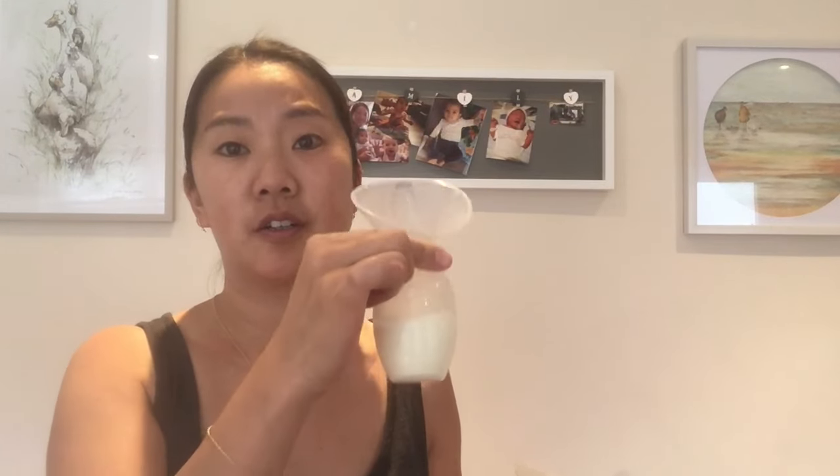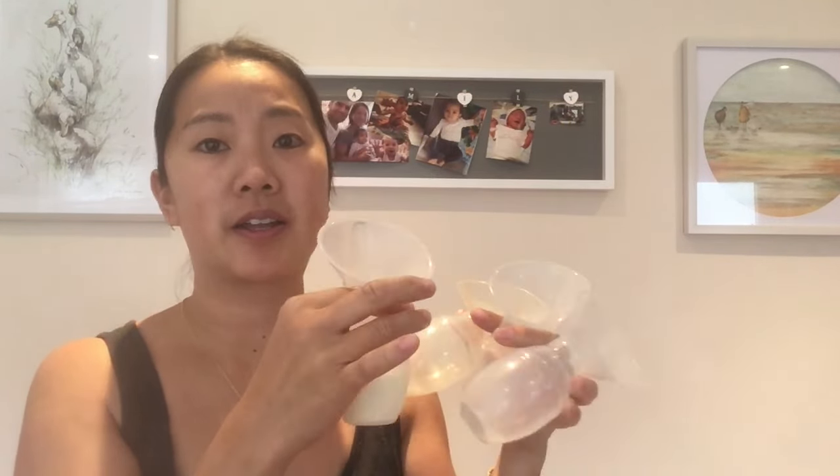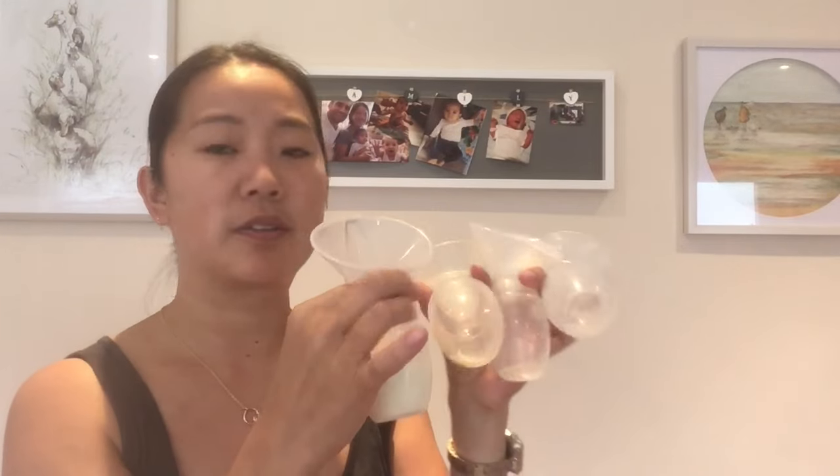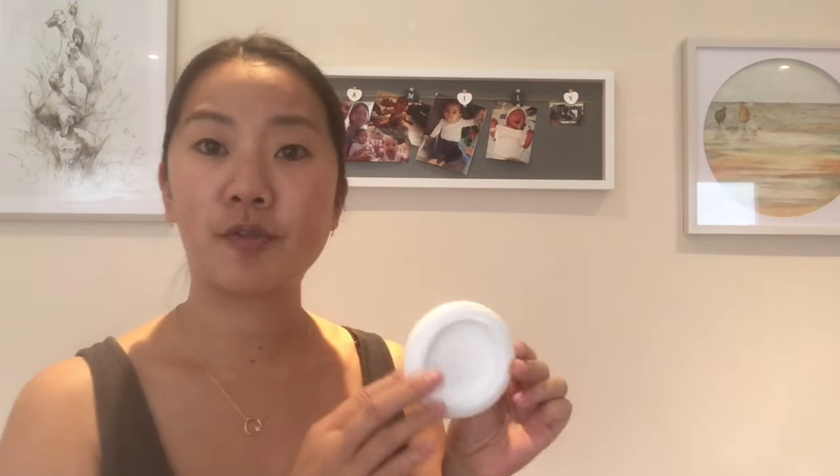If you find that you love these Haakaa pumps, I'd highly recommend getting a few more. I have four so that I don't need to wash them in the middle of the night — I just found them so handy to use.